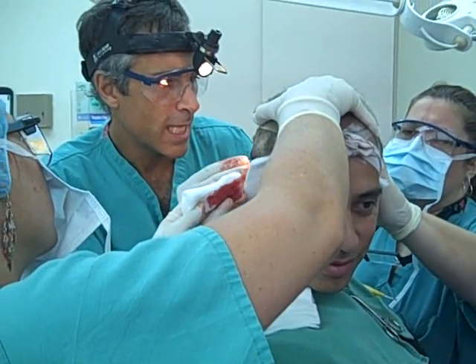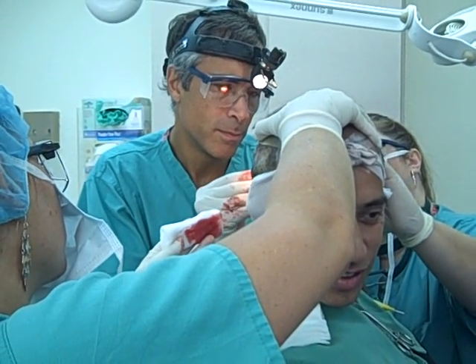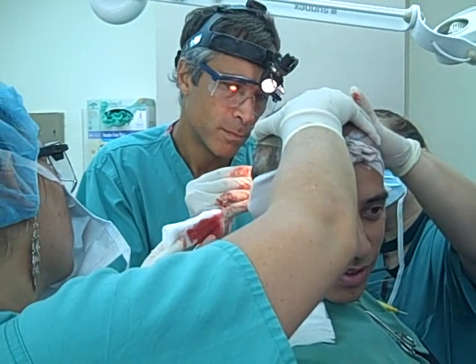You've got a nice loose scalp. It's nice. You get a nice large strip, which is nice. The bigger the better. Take it all.